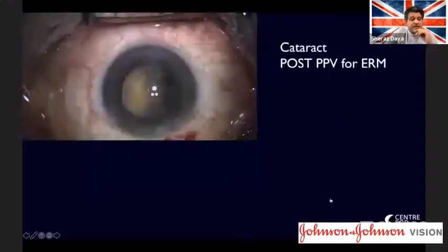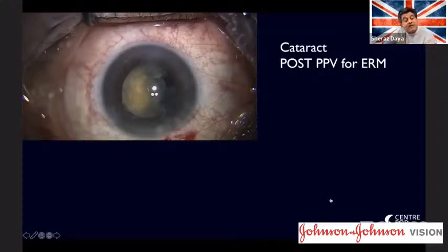And this is a case of a patient who had cataract post-pars plana vitrectomy, but he had a dense, brown, brunescent leathery cataract. All I could see was a brown lens there. And he'd waited for about 2 years before he decided to come and see us. He'd been down in the United States and was traveling through the UK. I took a look at him and said, yeah, I can do your surgery.